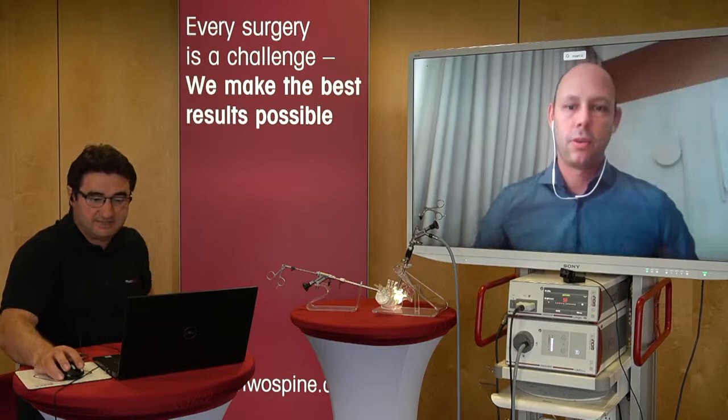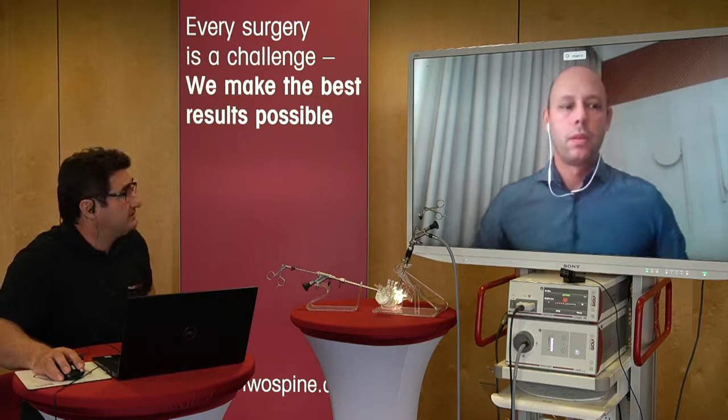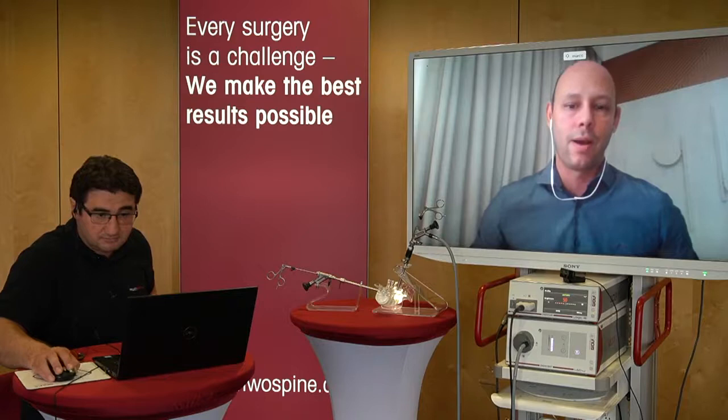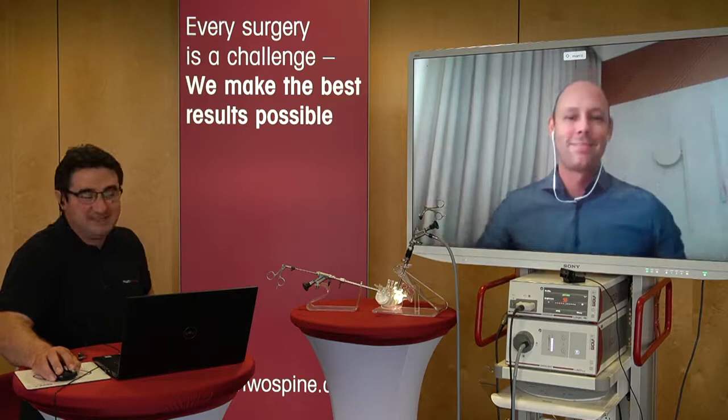Maybe we have another question. What size endoscope does Marco use in posterior cervical? Is it the same as transforaminal? I use the interlaminar endoscope in my cervical approach, because we don't have the cervical endoscope here in Brazil now. We don't have the registration for this material here. I use the interlaminar endoscope, it is not a problem. The difference for the cervical is the rongeur and the scissor. You need only a smaller one.